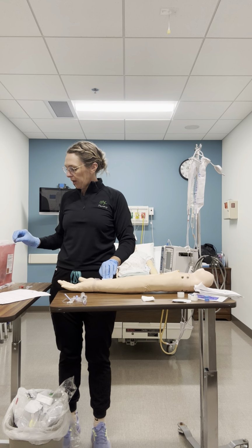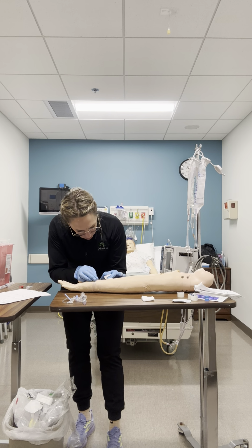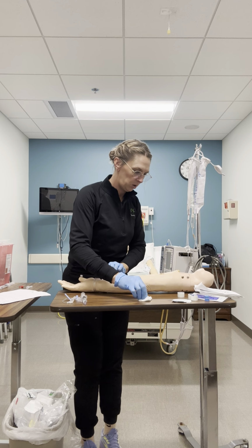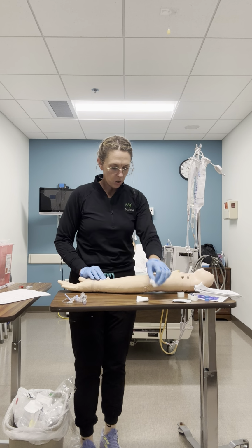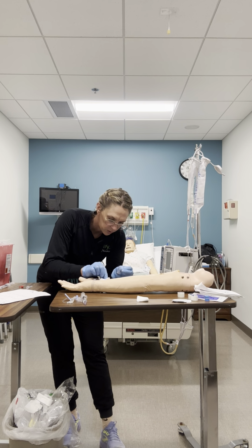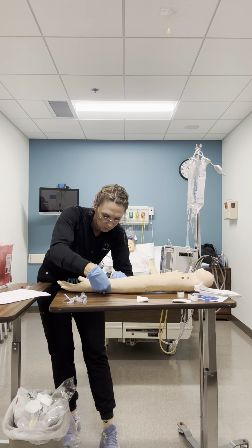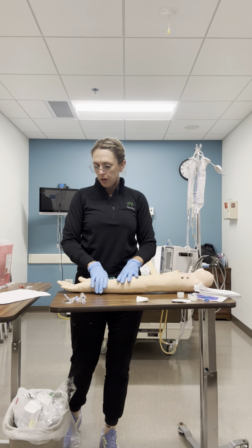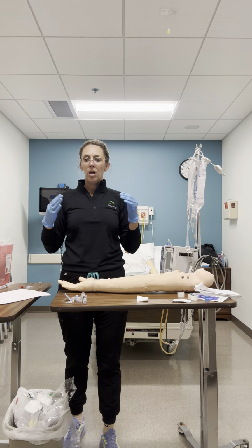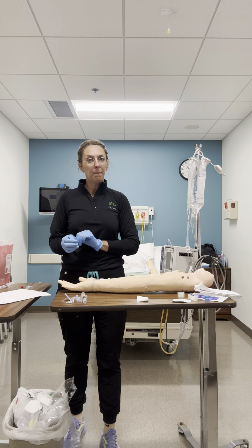So then I'm going to take my catheter. My catheter is going to go in my sharps container. I'm going to look at the insertion site and everything looks good. So then we're going to put a new gauze and we are going to cover this up. Good to go there. And then I am going to document per facility policy, making sure to note specifically that my catheter is intact. Yeah, thank you so much.